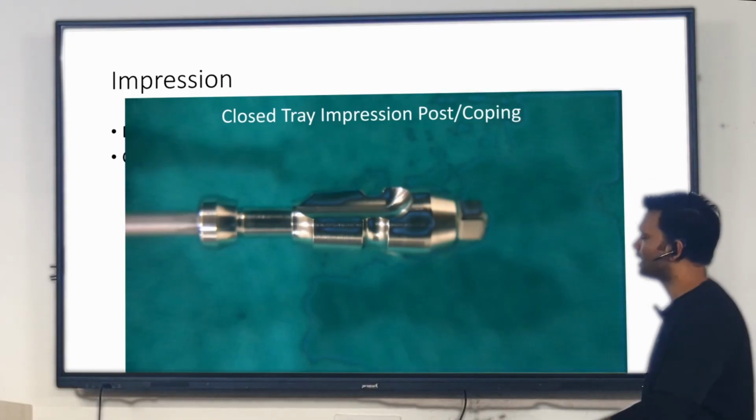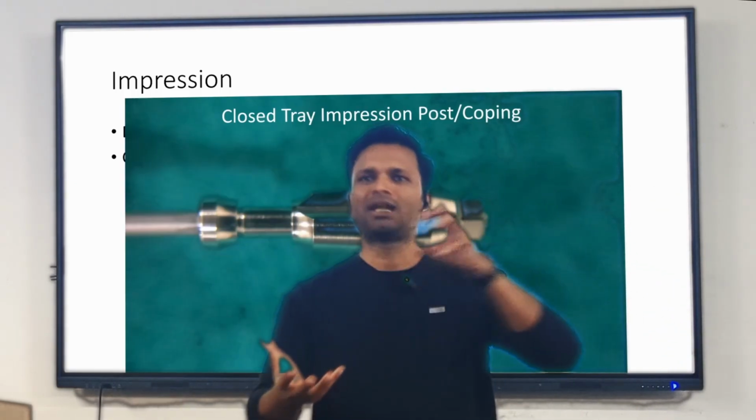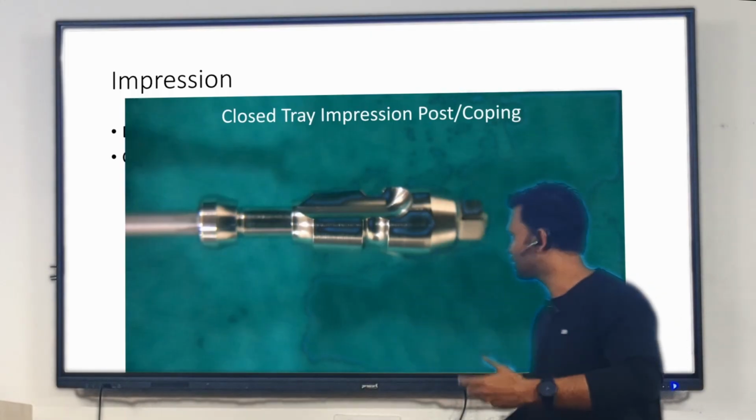Okay, so this helps in inserting the post inside the impression material and then taking it out also without causing much of a deformation. Okay, next.